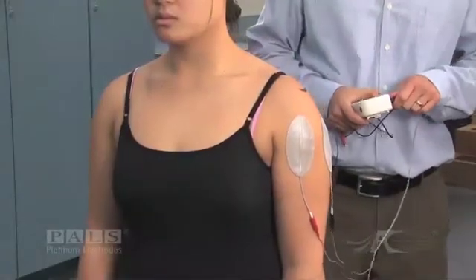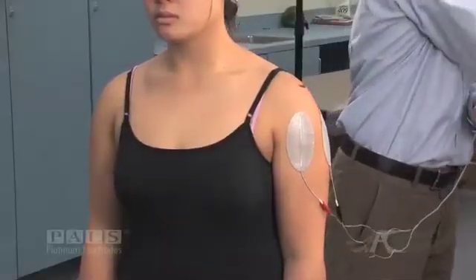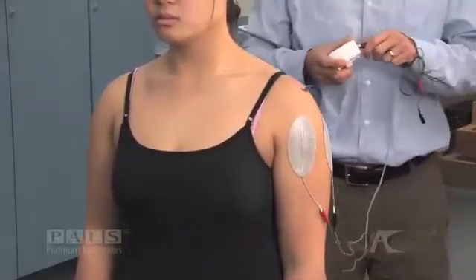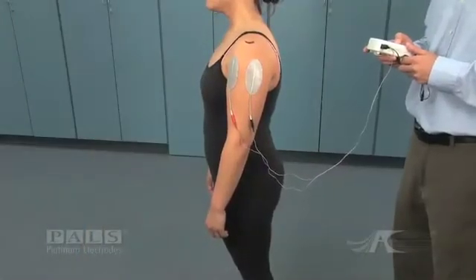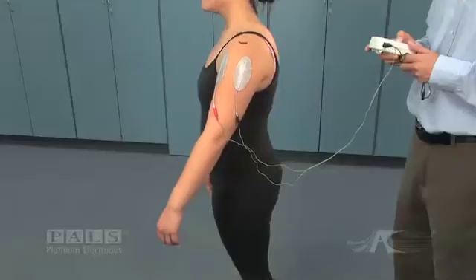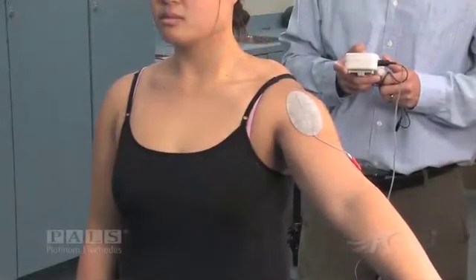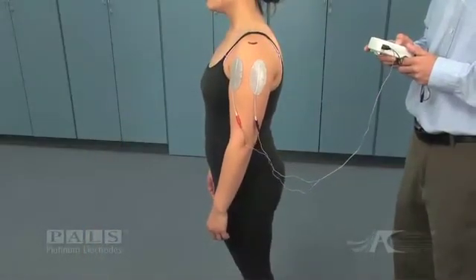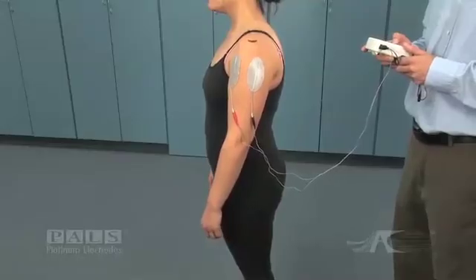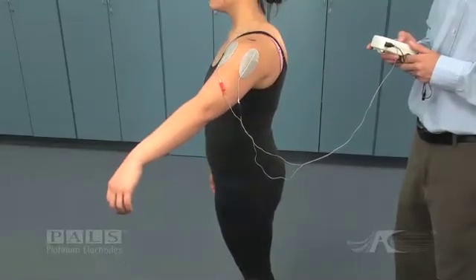Placing the stimulator on pause, the electrode leads are being disconnected. A second stimulator that is programmed with a symmetric biphasic waveform is being connected, and now as the therapist increases the amplitude, you will notice that both electrodes — anterior and middle deltoid — are equally excitable, resulting in a motion that would be referred to as scaption, a combination of flexion and abduction.